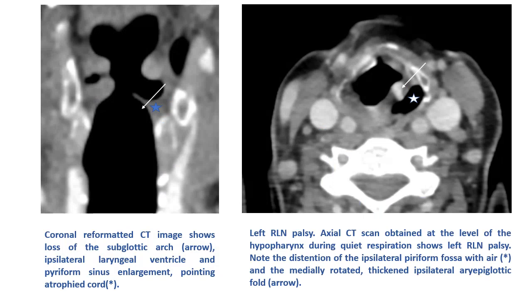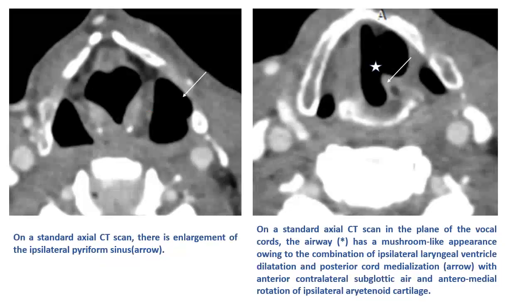Some representative images from our cases: a coronal reformatted CT image shows loss of the subglottic arch, ipsilateral laryngeal ventricle and piriform sinus enlargement and pointing, and an atrophied ipsilateral vocal cord. The image on the right shows a left RLN palsy where there is distension of the ipsilateral piriform fossa and a medially rotated thickened ipsilateral aryepiglottic fold. Another axial CT shows enlargement of the ipsilateral piriform sinus, and on the right there is a mushroom-like appearance of the airway due to a combination of ipsilateral laryngeal ventricle dilatation and posterior cord medialization.